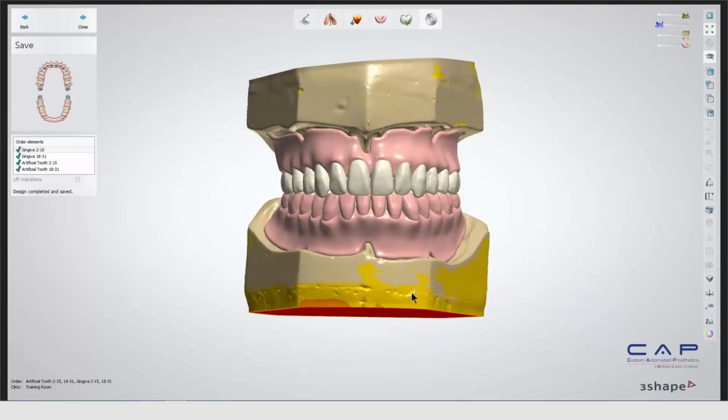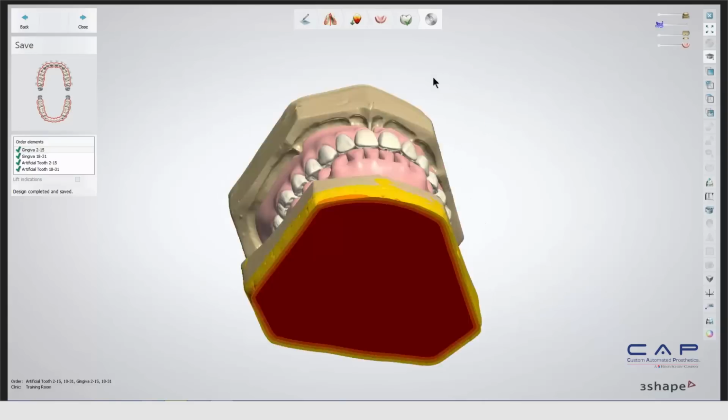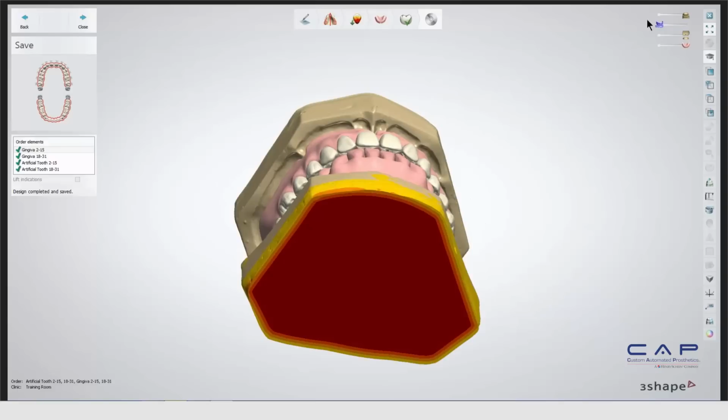Can you optimize the gum wax, i.e. the frenum? Yeah, you could do anything as far as morphing and adding and subtracting to the gum material or the wax up. So you can customize that as you would like. You can even go on the back side of the upper.